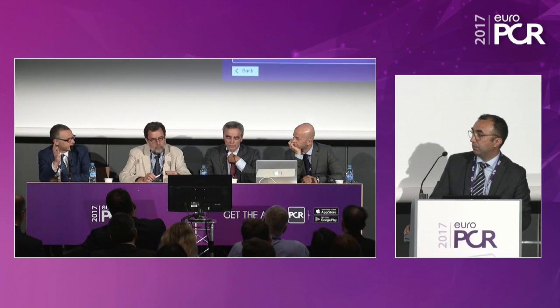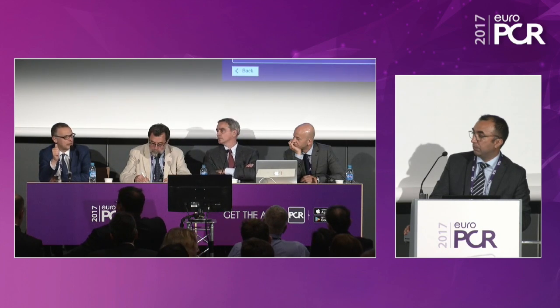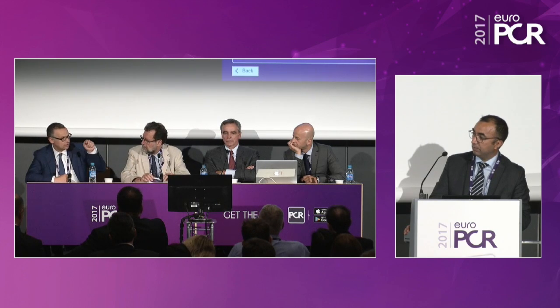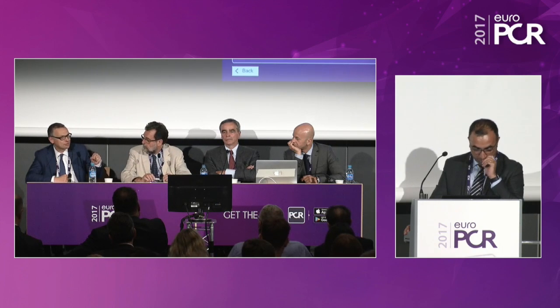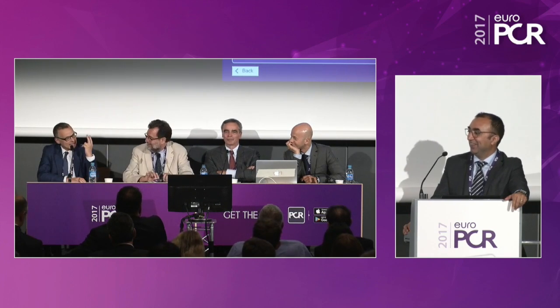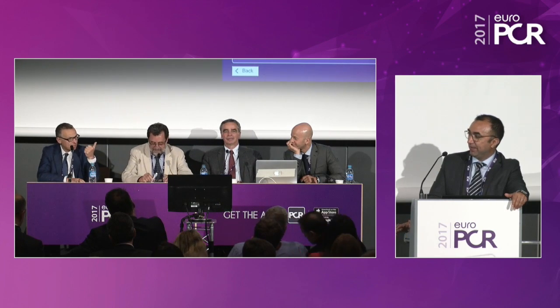What is the reason for that? There are at least two reasons. Number one, you implant this ring better than surgeons. I can only tell you because I'm a surgeon, and I know here I see that my screw goes in the ventricle. I put each screw in the base of the left ventricle. In surgery, I don't see where the left ventricle is. I just see the endocardium of the left atrium, right? Really? Sure. Oh, disappointing, huh? So fixation is very solid here, and it targets the base of the ventricle.